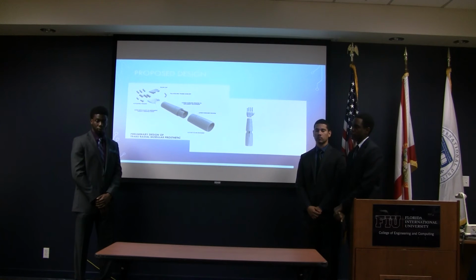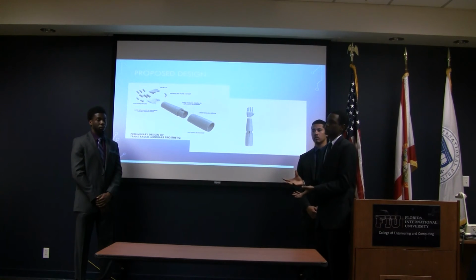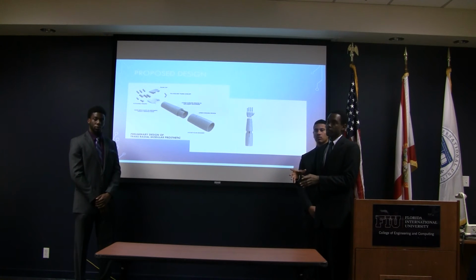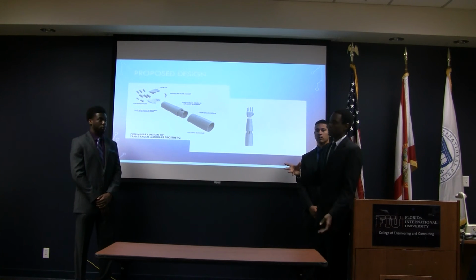So phase one was first dealing with the mechanical side of creating a prosthetic, making it able to withstand the weight of a human being, because that's one of the standards they established for making prosthetics. And then the second phase is adding those mechanical driving elements.